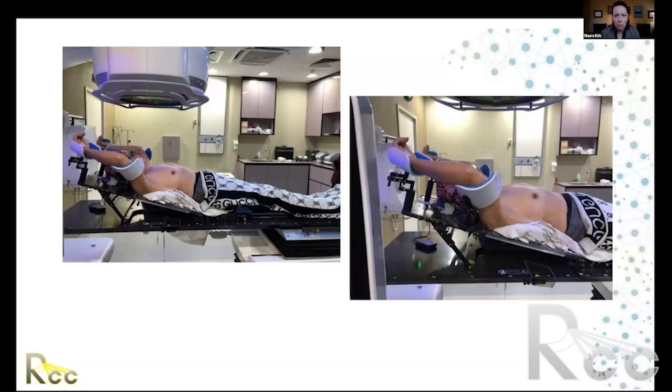Justin, I don't know if you have more input on this. I think frequently our therapists leave it at a single angle so that they don't have to reposition the board for each patient. I think you've explained it very well, Maura. The only thing I would add is that if the angle becomes steeper, the patient becomes higher on the table, and there is an increased risk of a collision. Thank you. Yes, great point.